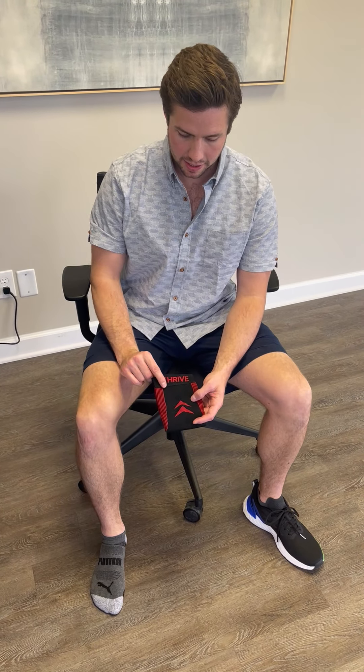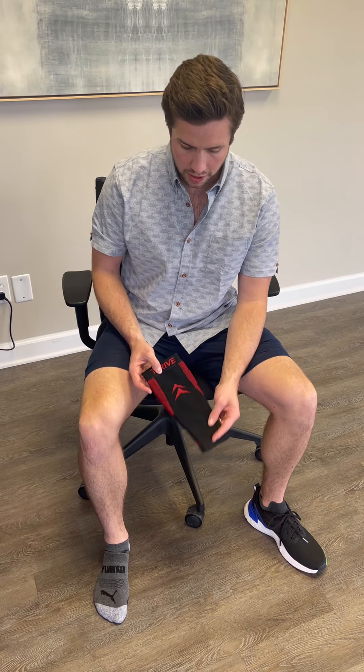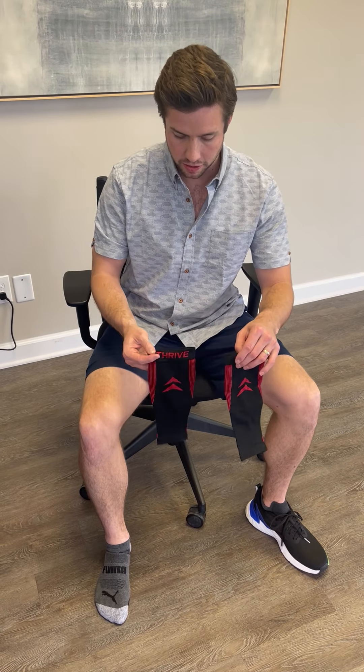Hi, I'm Joe from Thrive Orthopedics, and today I'm going to tell you about our new AFO accessory, which is a compression calf sleeve. Each order comes with two, so you can either use them on both legs or just have a spare when you're washing the other one.